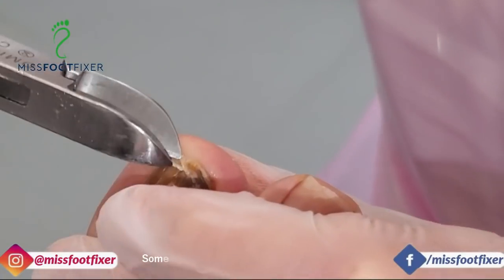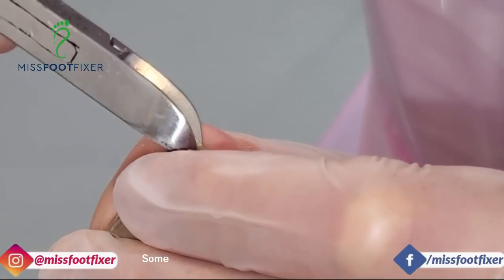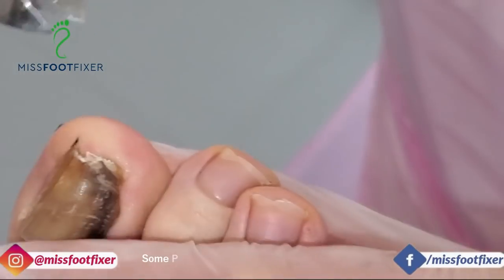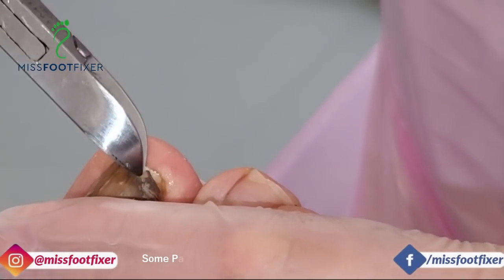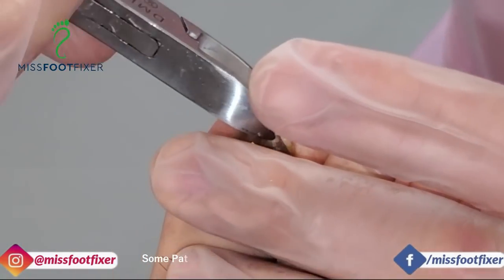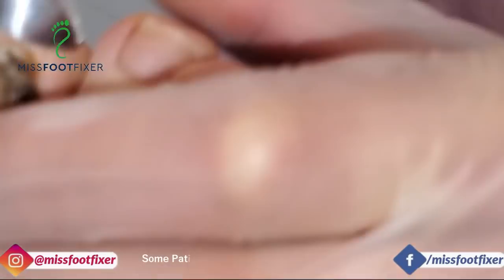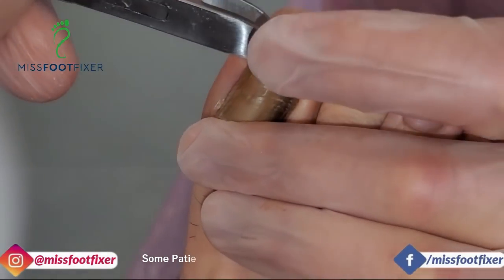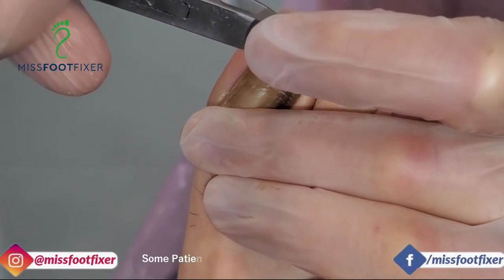Kenny is doing nail surgery, not nail surgery, nail cutting. There you go. Little tiny bits. Yeah, just take it slow. Yeah? Yeah. This one will be more painful. This one is going to be less cut.